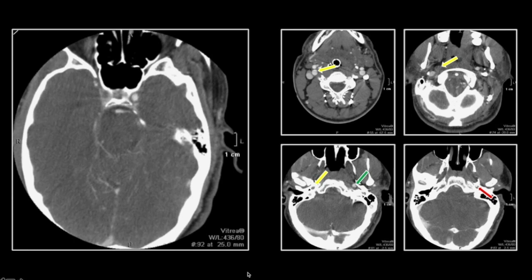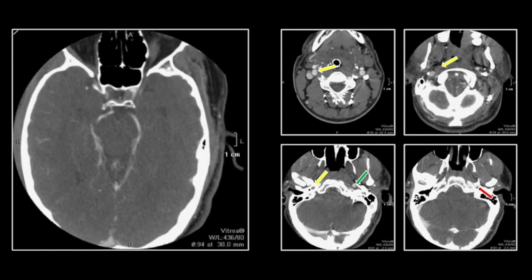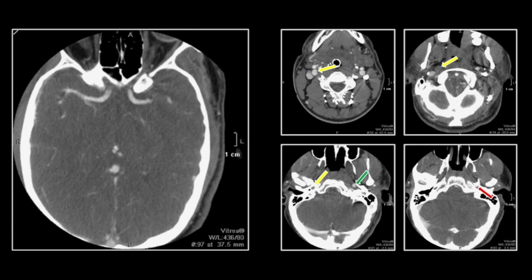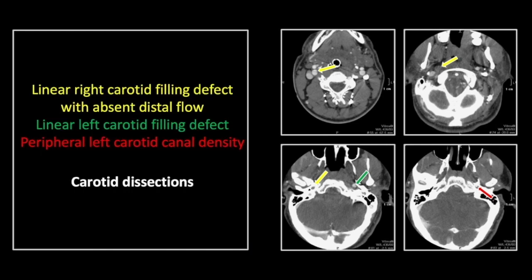At the highest level, you can see the right internal carotid continues to not fill, and there is ultimately collateral reconstitution of the right intracranial vessels. So this was a motor vehicle collision resulting in a bilateral carotid artery dissection.